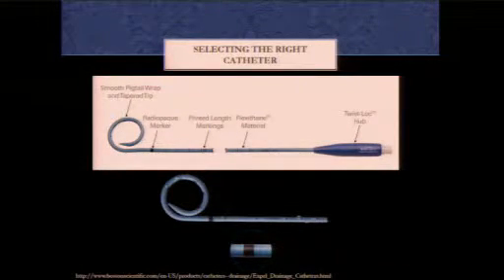In terms of selecting the right catheter, from my research, it looks like most of the catheters are fairly comparable. I'm not certain about cost. I contacted a couple of the vendors, but they were not able to get back to me on cost of the catheters. But the majority of these catheters will have a hydrophilic coating.